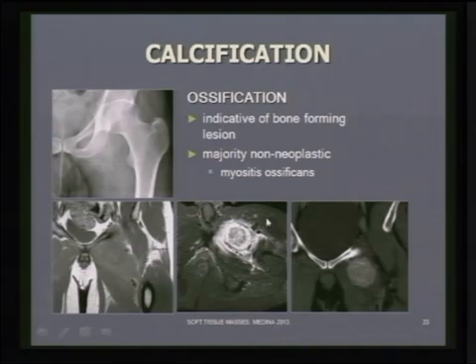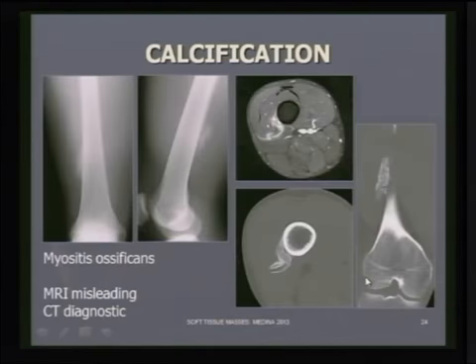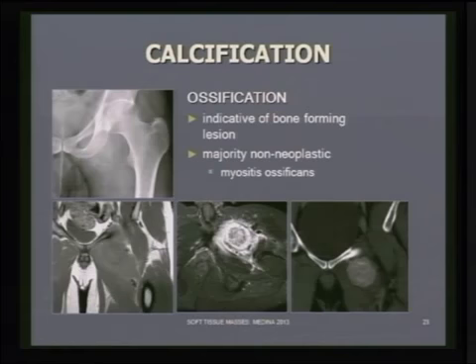And what we do with these, we do not biopsy them at this stage, but we will refer the patient for a CT study to show the more classical appearances of this peripheral ossification. This is a case where the patient has been imaged on CT several weeks after the MR findings, and so the lesion has matured quite significantly compared to the appearances on the MRI.